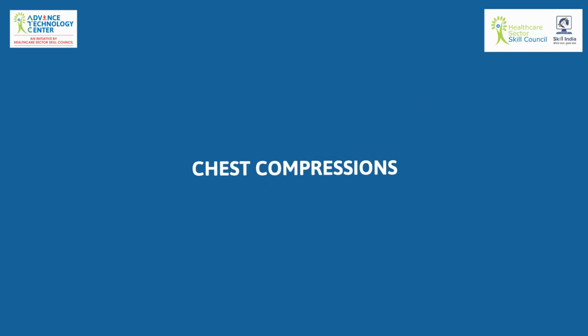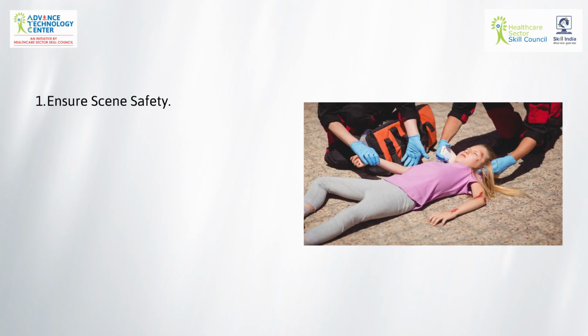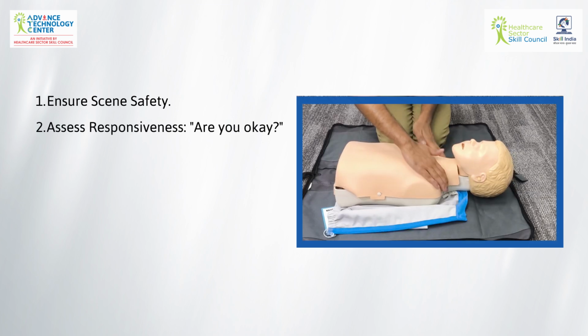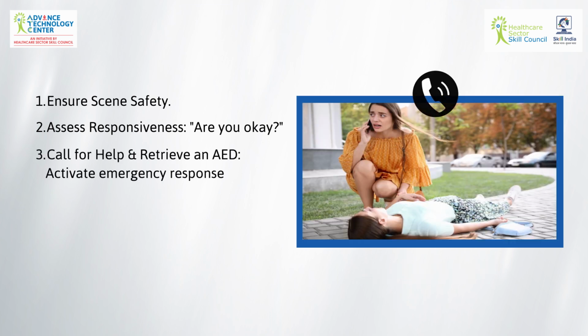Chest compressions. 1. Ensure scene safety, check for hazards before approaching the child. 2. Assess responsiveness, tap the child and ask loudly, "Are you okay?" 3. Call for help and retrieve an AED. Activate emergency response if the child is unresponsive.